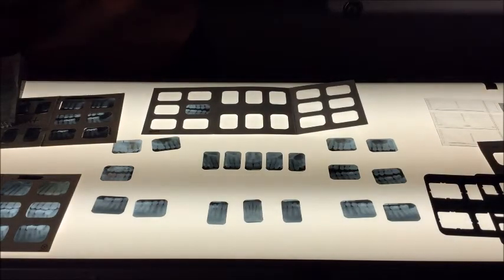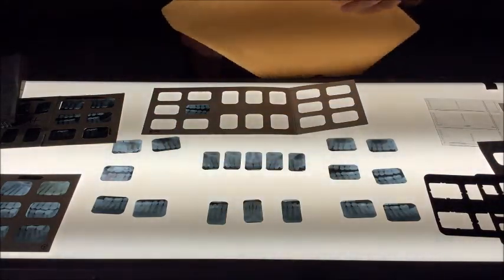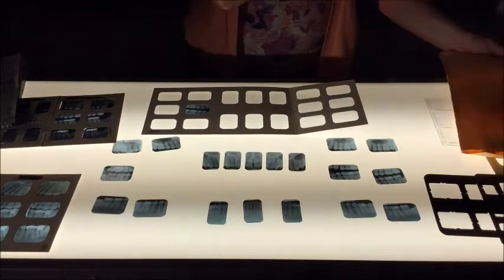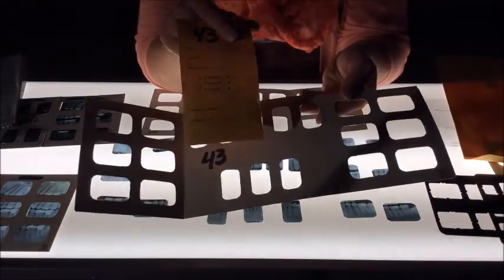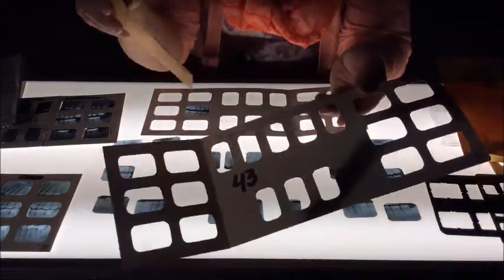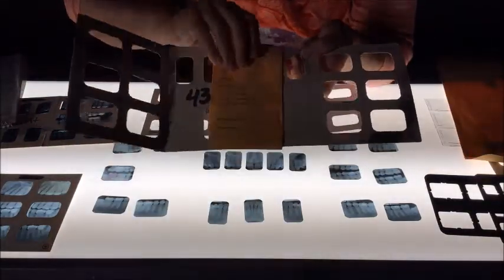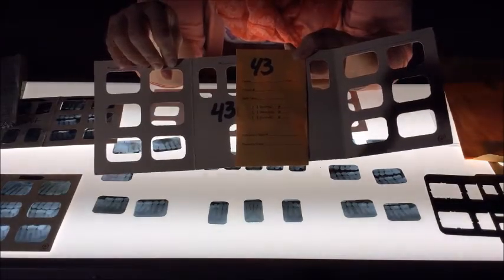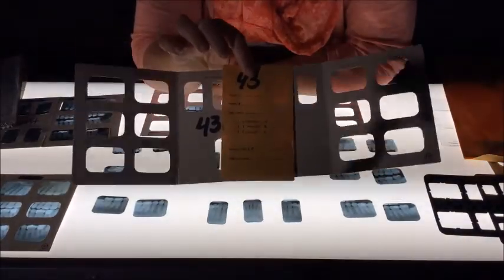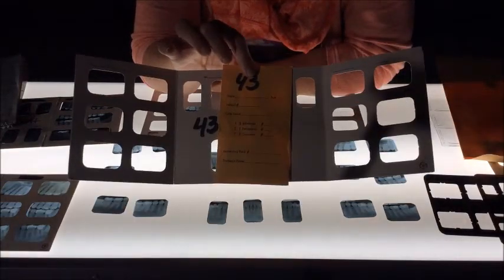You will be presented with a packet. We have many packets for everybody to experience with, where there will be a film mount located in there and a coin envelope with film. Could be up to 20 film in there. You'll place the coin envelope onto a view box, and then you will orientate based on labial film mounting that you were shown in this video presentation. Once you have mounted your conventional film, you will show it to your lab instructor, and then you will continue to practice this.